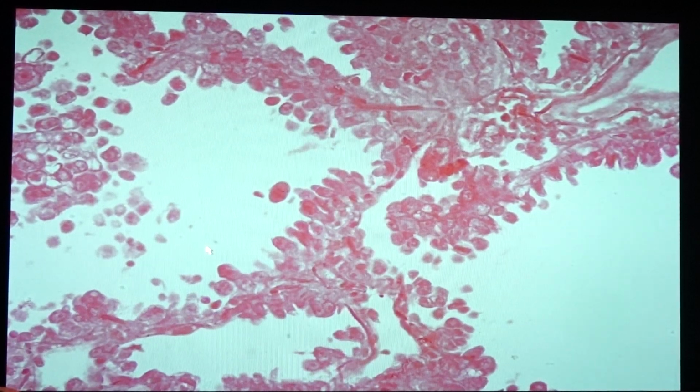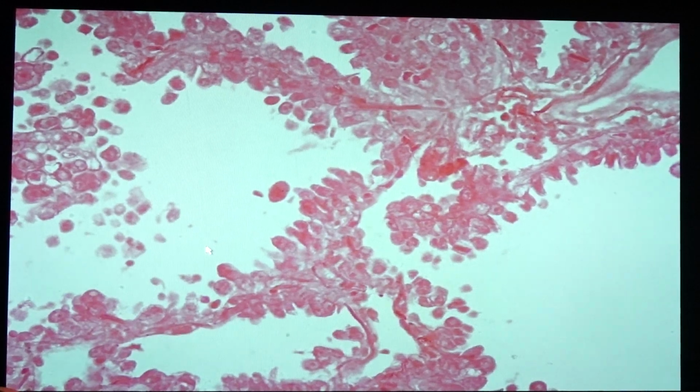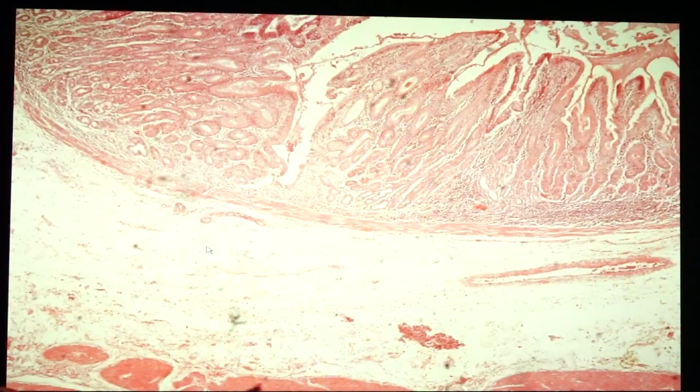This is a pre-invasive neoplasia. Okay, so this is from the lung. Next, we have slide 103. Slide 103 is from the stomach.